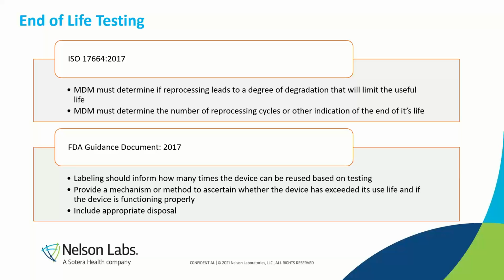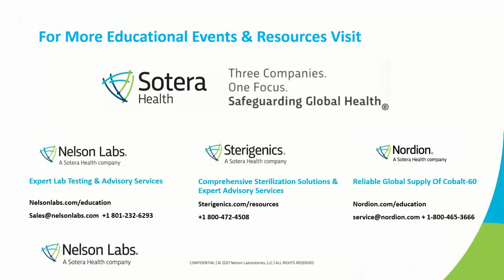So these are things to keep in mind as you prepare for cleaning validations in the future, is also to look towards end-of-life testing, as this is something that is being discussed heavily in the industry right now and is being looked at. So you may want to look at it as well and determine what your end of life is for your device. And that brings an end to this discussion on the changes coming to cleaning validations as found in ST98 and other documents.